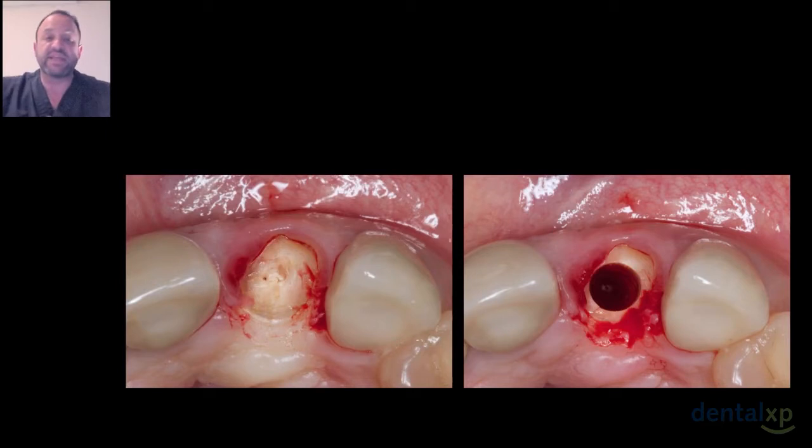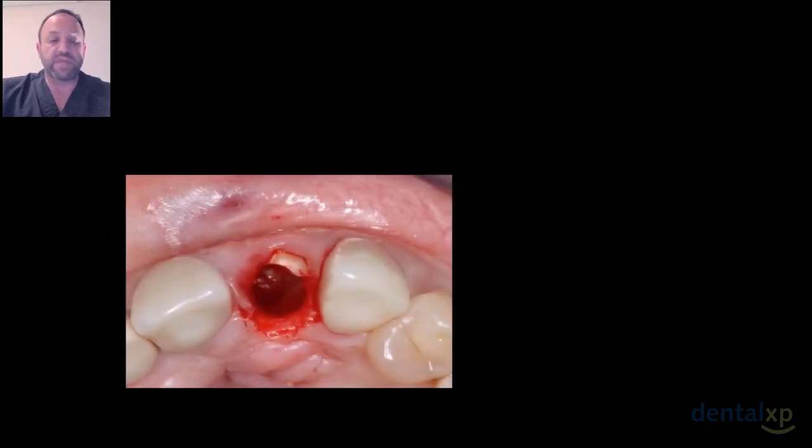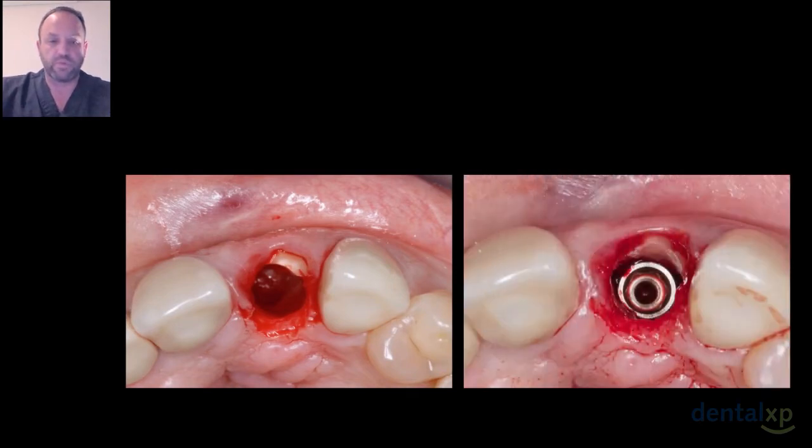What they did is they took implant drills and gradually expanded the implant hole through the tooth. Once they'd expanded it wide enough, as you can see from the slide on the right hand side, they created small cuts on the mesial and the distal, and once those small cuts were made, they took out the palatal root, leaving only the buccal shield. Once the buccal shield was done, the implant was placed.